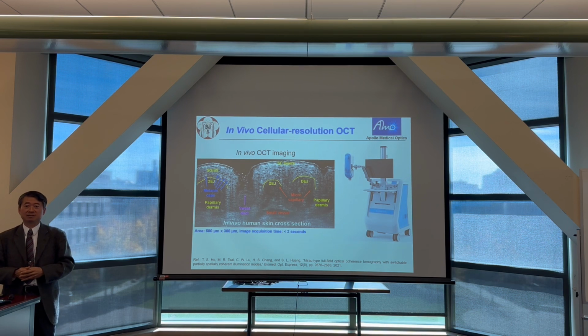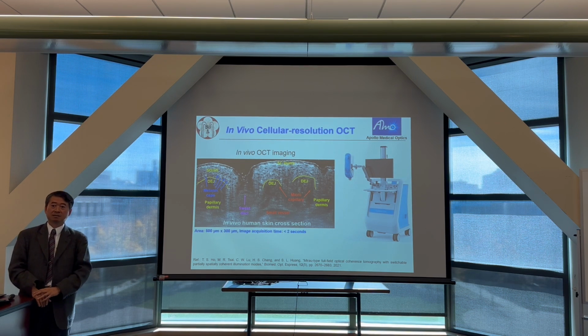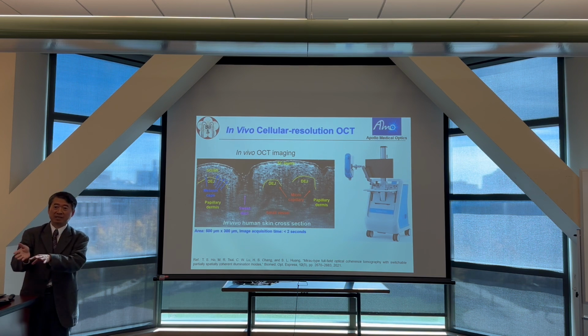Okay, so this isn't a question of scanning hundreds and hundreds of people and then looking for those that have skin cancer. This is actually looking at the cancerous regions and then diagnosing them. Yeah, and trying to find out where the boundary is between the malignant and the benign tumor.